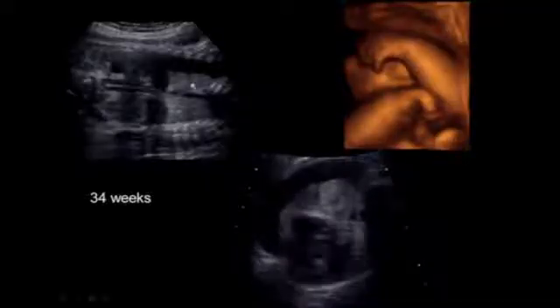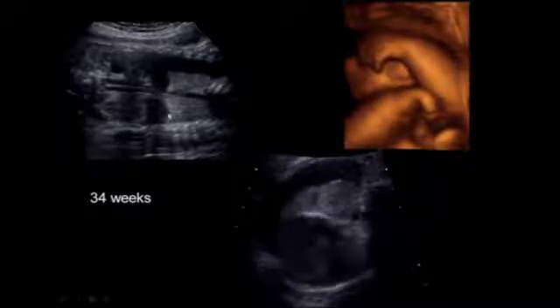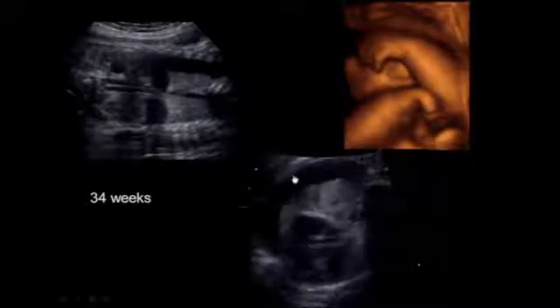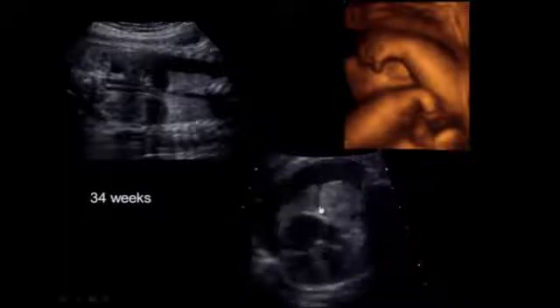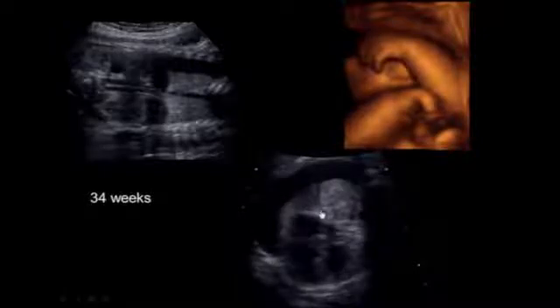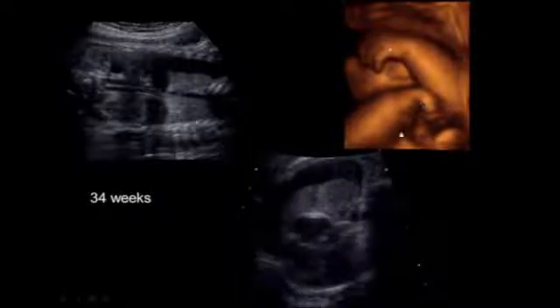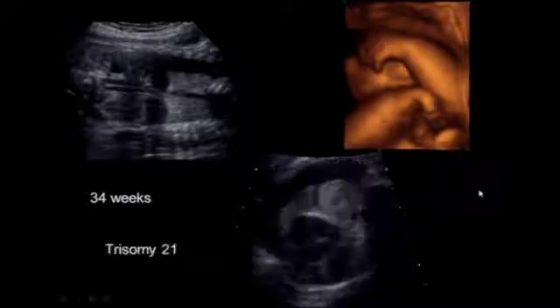Here's a fetus who came in with bilateral pleural effusions, and you can see on this coronal image the subpulmonic component of the pleural fluid on both sides. And you can see actually that this fluid is separating into the right lower and middle lobes. You can see the fissure right here. And this fetus with the pudgy hands didn't want to let us see its face, but turned out to have trisomy 21.